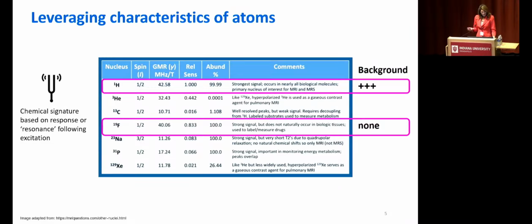So there are other methods that can be used, and 19F is one of them. 19F, simply fluorine. Think back to the periodic table. The benefit of fluorine MRS is that if it's fluorine in our biological environment, 100% of that fluorine is 19F. That's in contrast to something like carbon-13, where only 1% of carbon in our environment is in its 13 form.